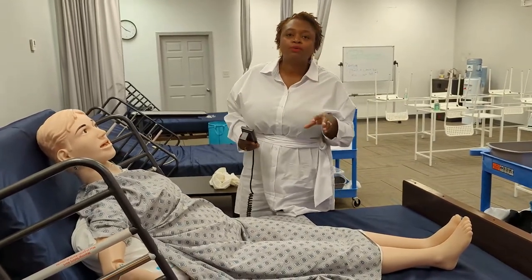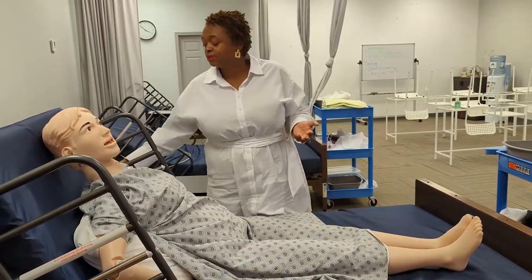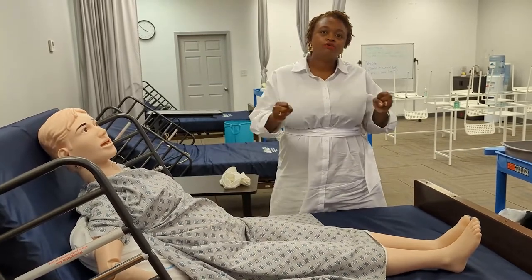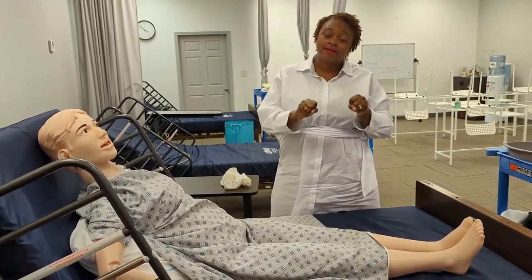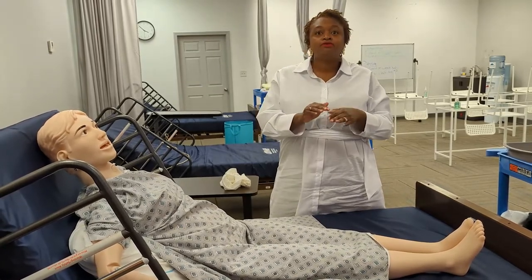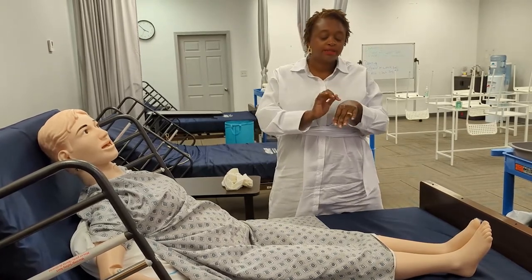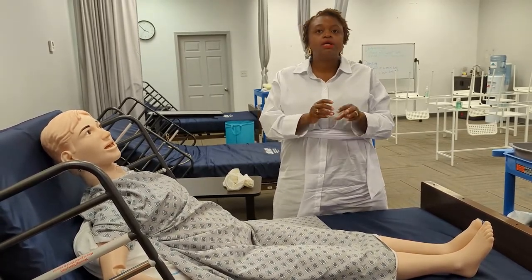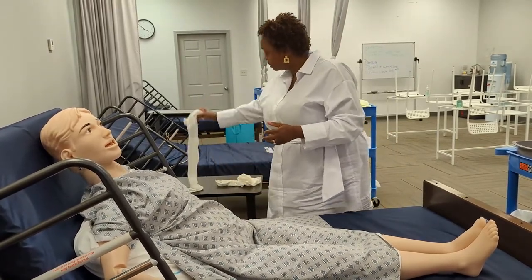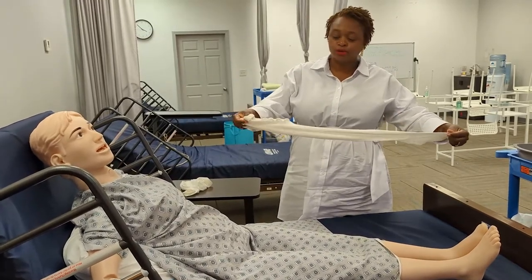What I would do with some of my students is actually serve as the patient and have them place the stockings, because honestly, until you place them on a real person, you don't really get a sense of how tight they are, and you really could inadvertently pinch the patient's skin. Sometimes elderly people or people of different complexions have thinner skin, so be careful. We'll do our best to demonstrate the principles with the mannequin, but a real person adds a little more nuance.